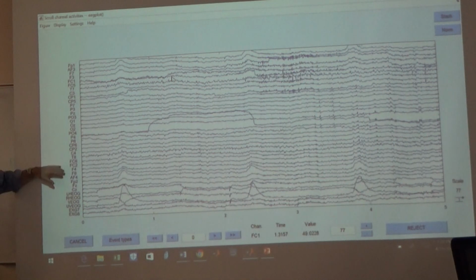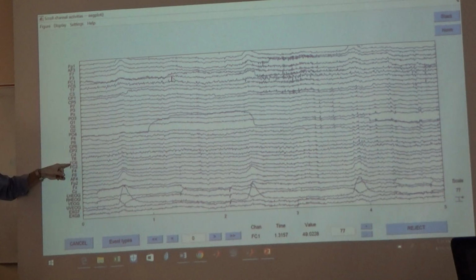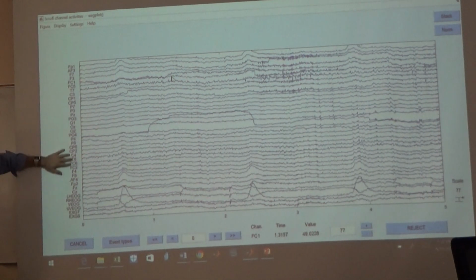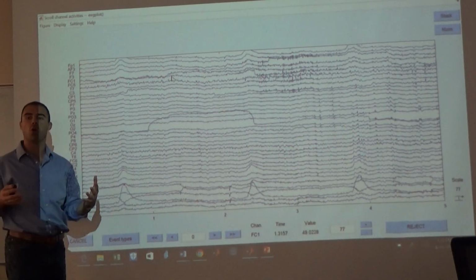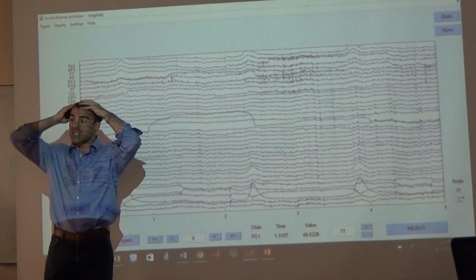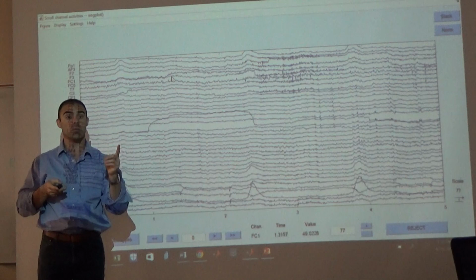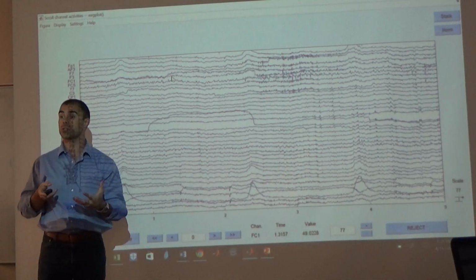So you remember you labeled that earlier on the VEOG, and we labeled it on the HEOGs. Okay? It tells us what the name of all these sites are, but the computer system does not yet know the coordinates on the scalp that they are actually at. Okay? So the first thing we're going to do is we're going to load channel location information.